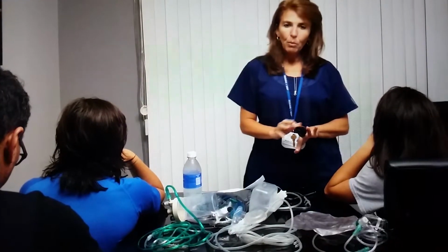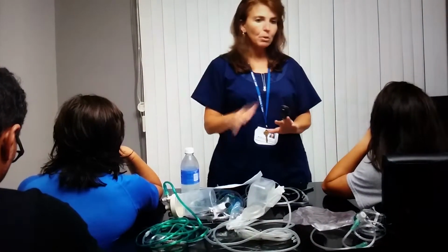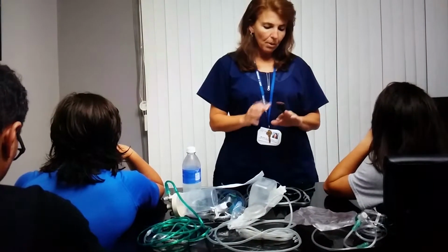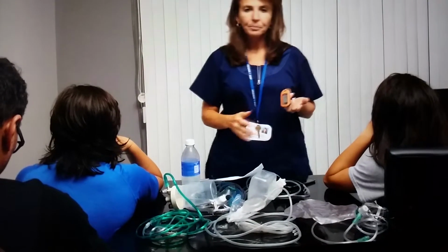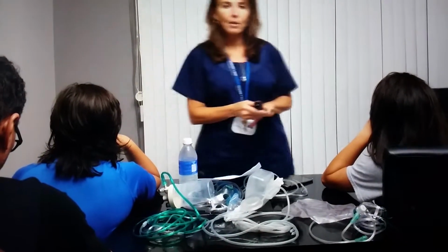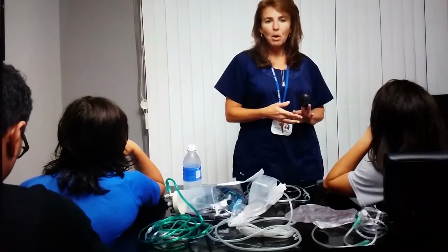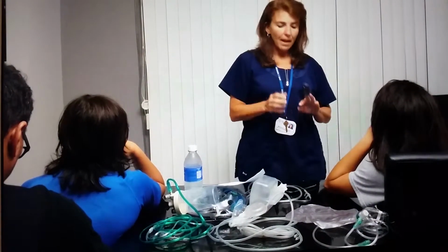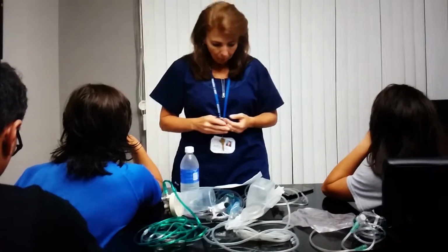You can also look at the waveform. If you have a big table-side pulse oximeter, you can look at the waveform graphics, or the pulsatile signal on the small oximeters as well. If you're ever in question whether the reading is valid or not, you'll want to take an apical or a radial pulse, and then correlate that with the heart rate that's on the pulse oximeter. So those things are very important.